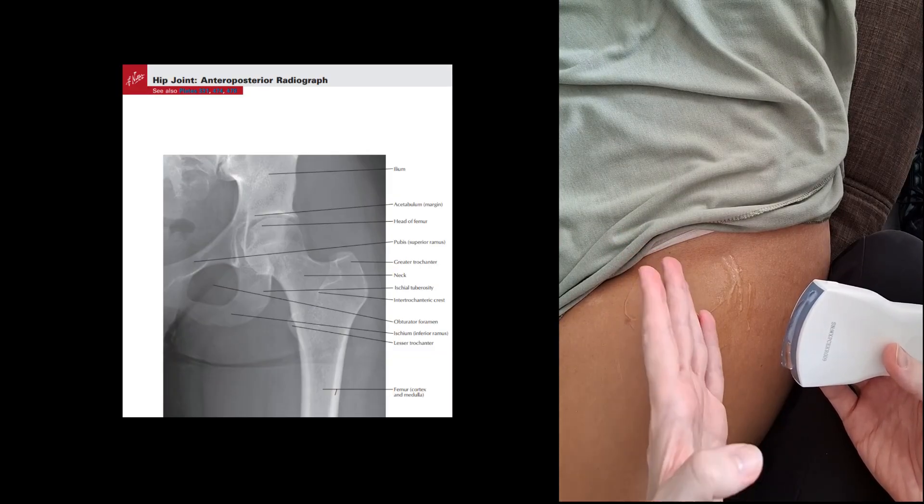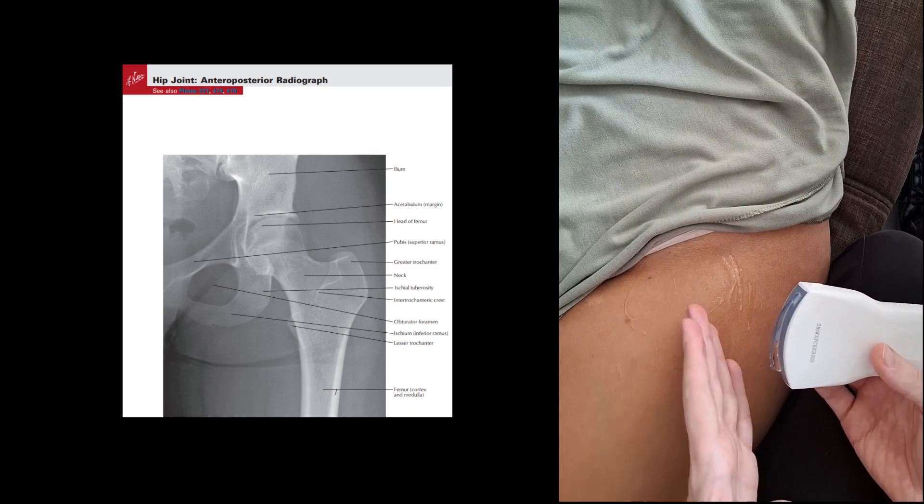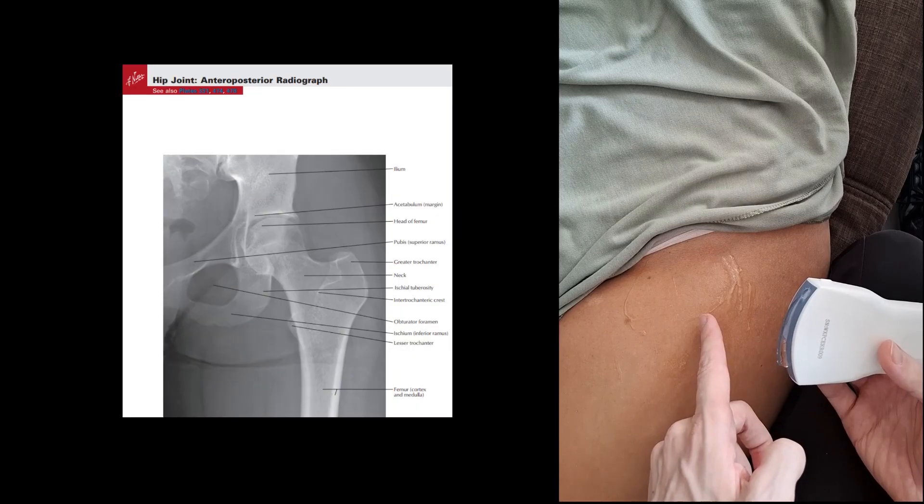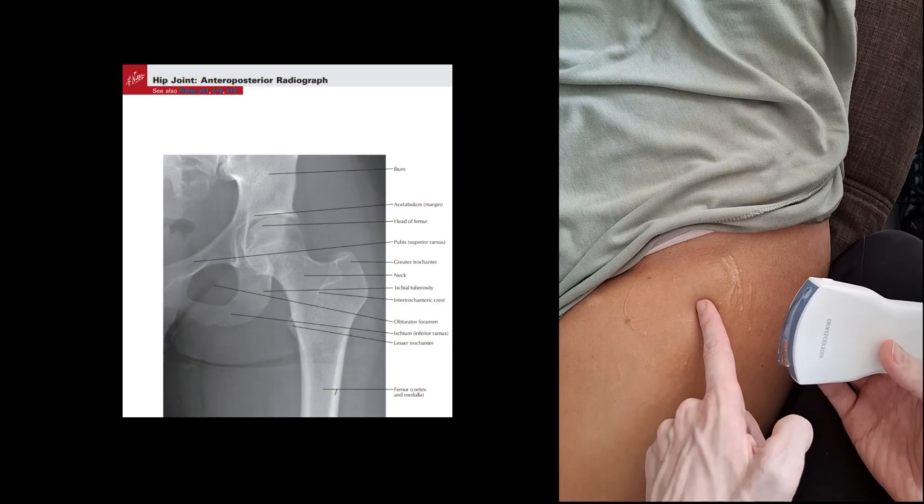So we're basically looking at the head of the femur and the neck, and we want that long axis. We'll take the measurement for whether there's joint effusion or not basically on the neck of the femur. And here we go.